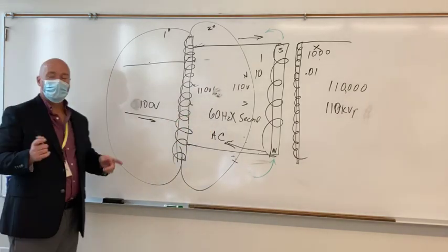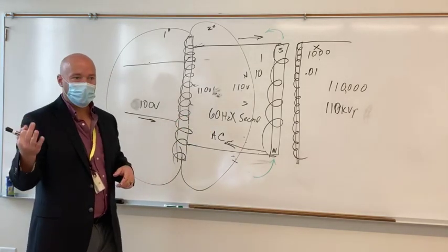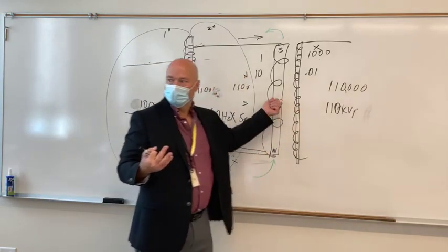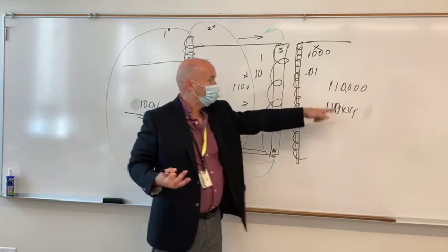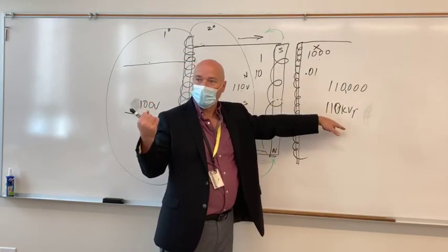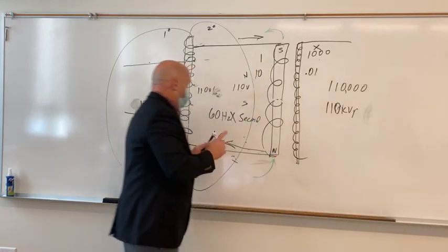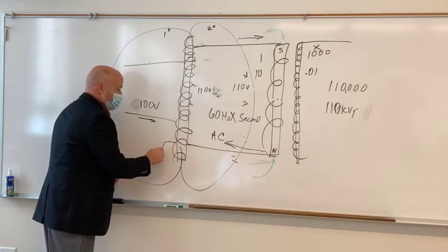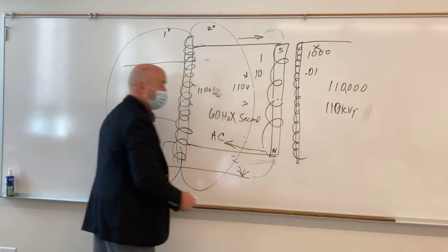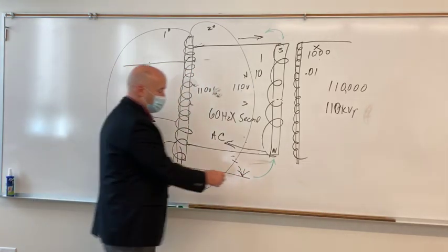So what we need in our exposure is really three things. When we make an exposure, what are the three components of X-ray exposure? kVp, mA, and time, right? So at the same time, what we're going to have is a secondary circuit. That secondary circuit comes off in parallel to the primary circuit.